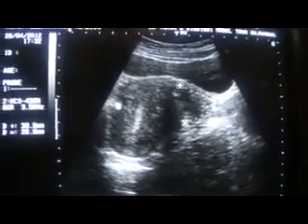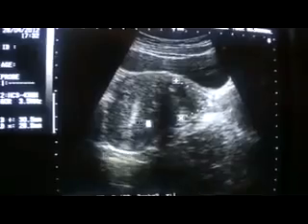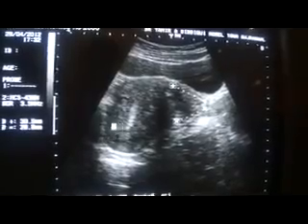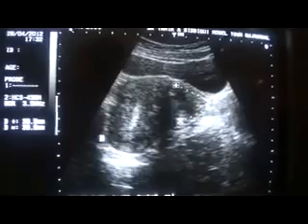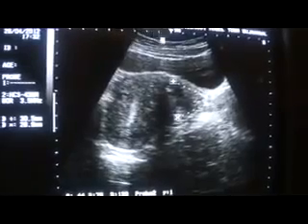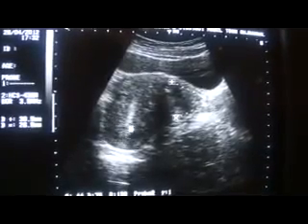See? Now you can see it clearly. Here I am in transverse section. So no question of fibroid. Rather, be very careful. In a retroverted uterus, do not mention a fibroid at the fundus of the uterus. So this is a point of caution regarding the ultrasound of the retroverted uterus.